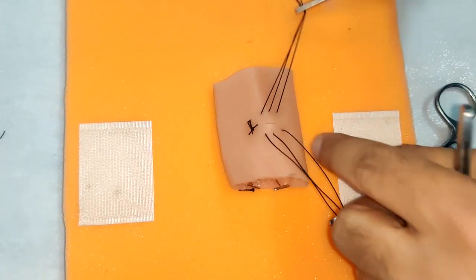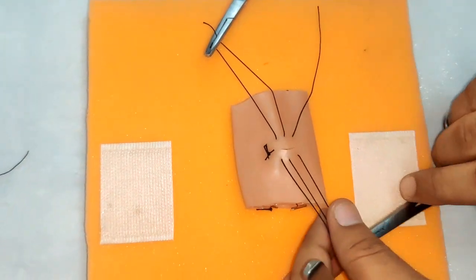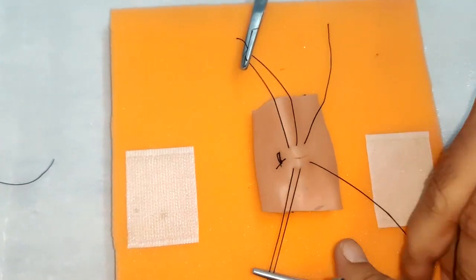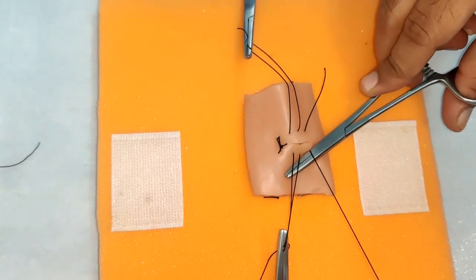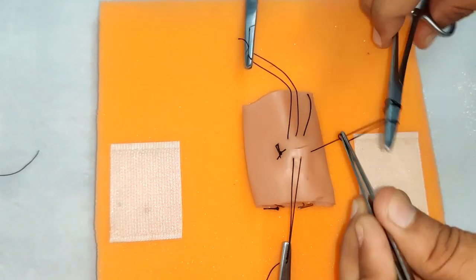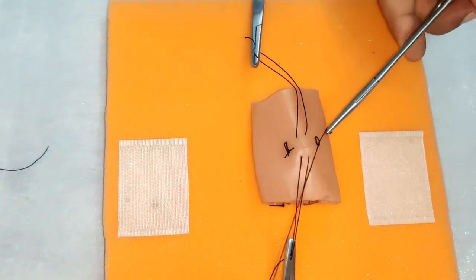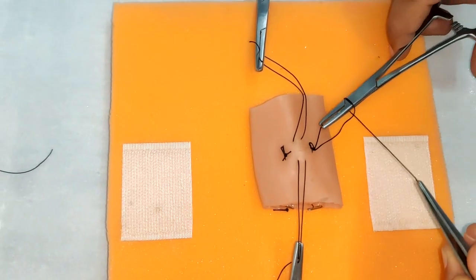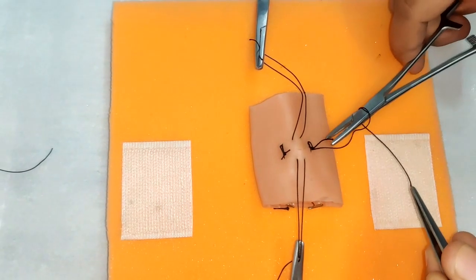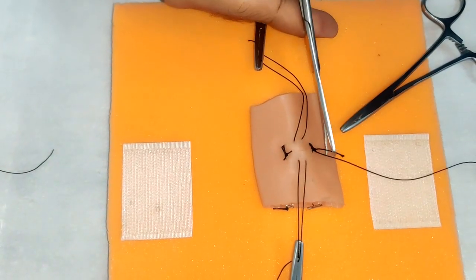Now again we will suture the lower end. We start again by a simple instrument tie and finish by cutting it.